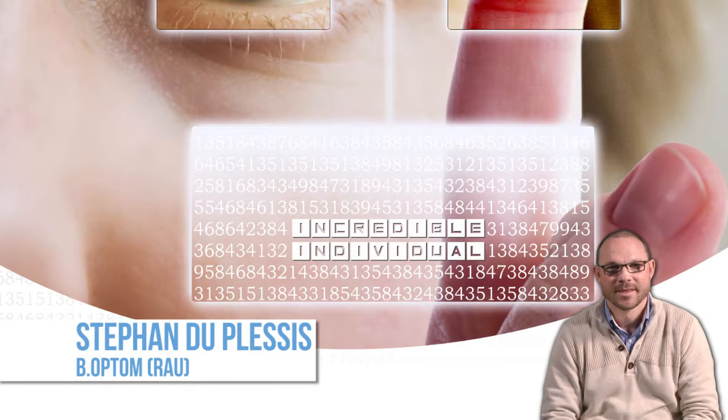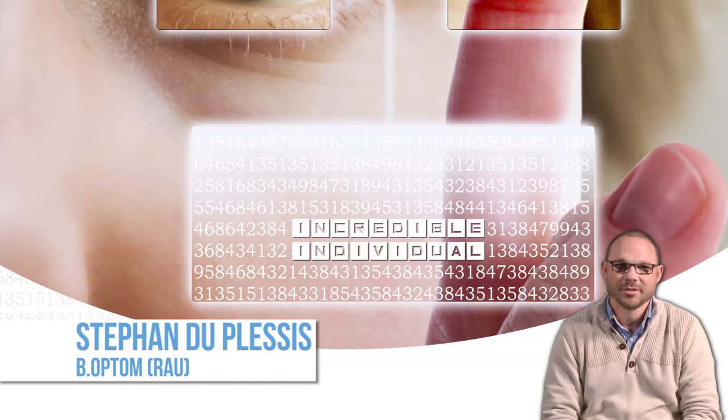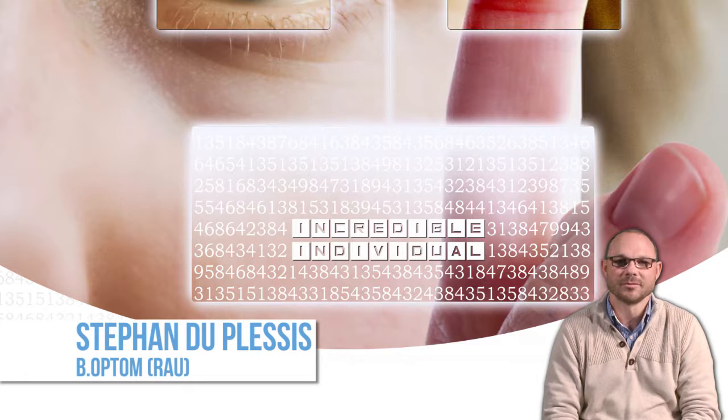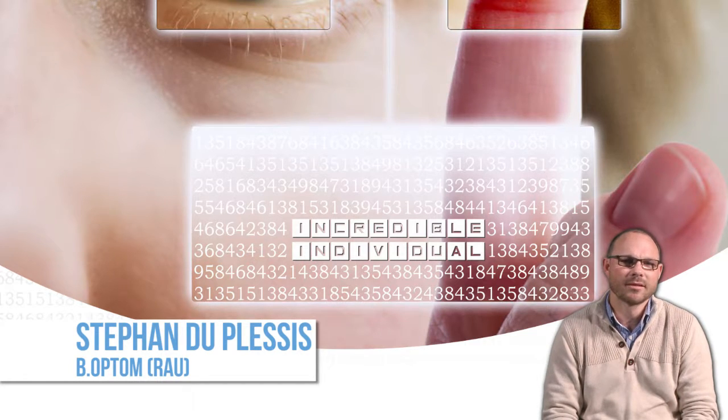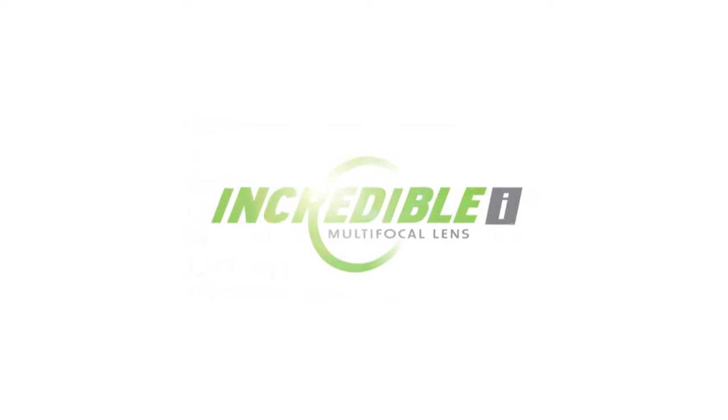Hi there, Stefan from Hoya. I'm here to introduce you to the incredible individual multifocal. So what is new about the incredible and why do we call it the individual?